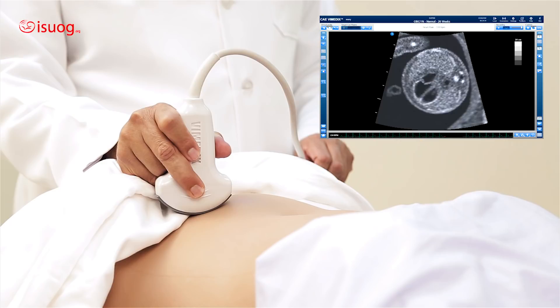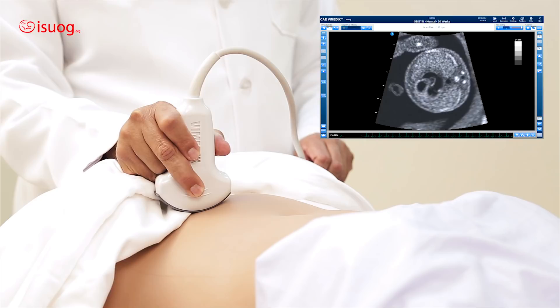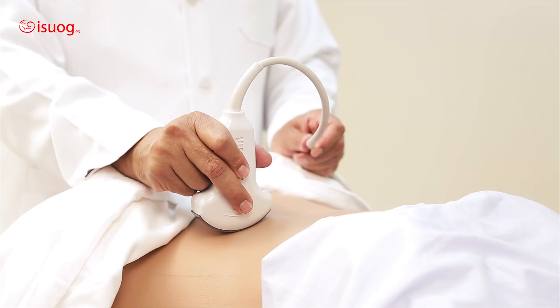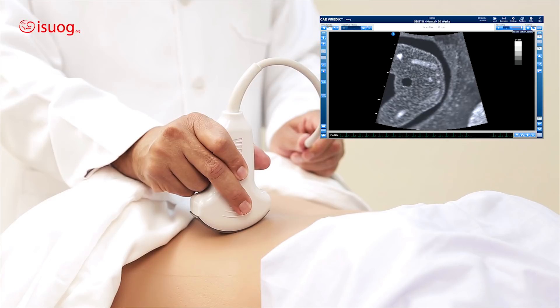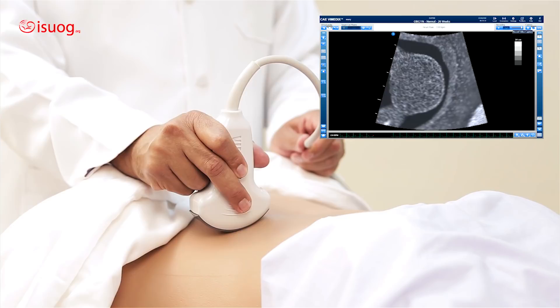The next example for sliding on the broad axis is examining the fetal vertebrae on an axial view. If you look at the screen, I'm at the level of the bladder — so I'm at the level of the pelvis. If I want to examine the vertebrae in an axial view, I will just slide on the broad. And as you can see, I can see the vertebrae in an axial view.